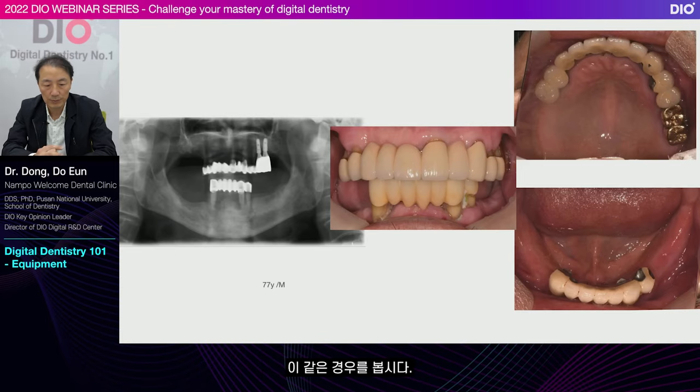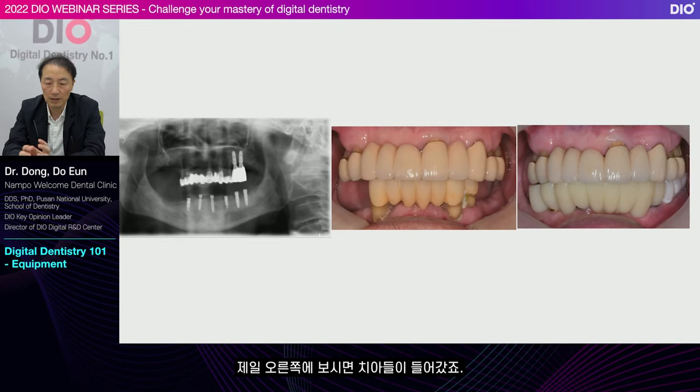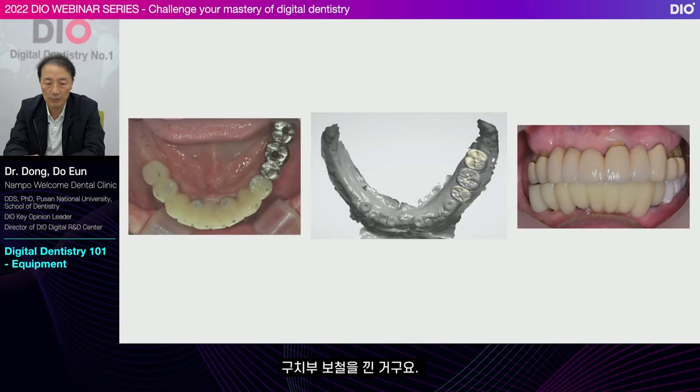Let's look at this case. This patient got implants in the mandible, but before extraction, I could take the oral scan to keep the original teeth as digital data. And after extraction and placing implants, I load the copy of the tooth on the right side. There are teeth on the far right side. Then, in this way, you can place the prosthesis while maintaining the VD or occlusion. This is with the posterior prosthesis in place.